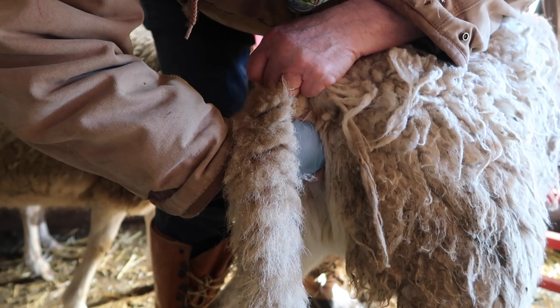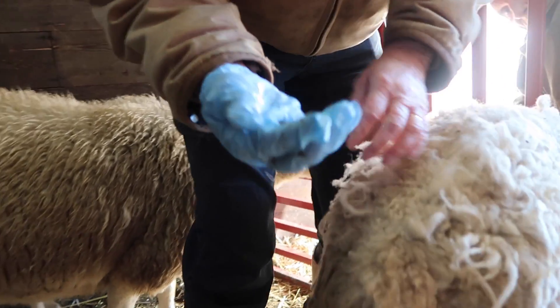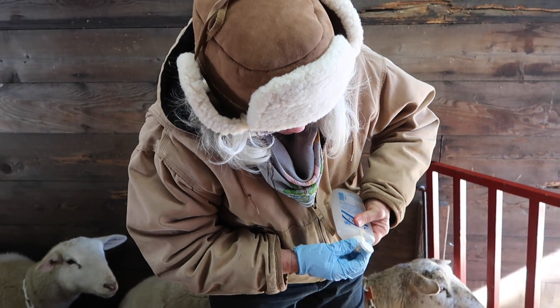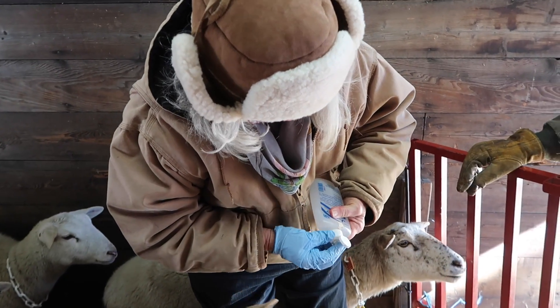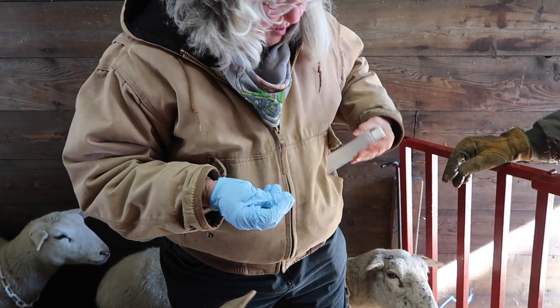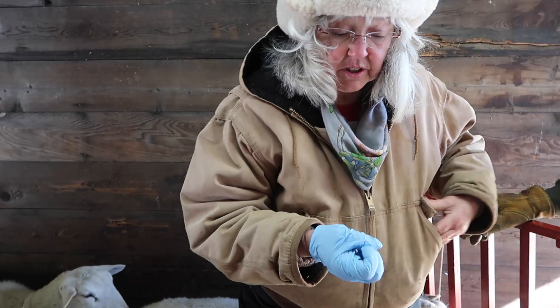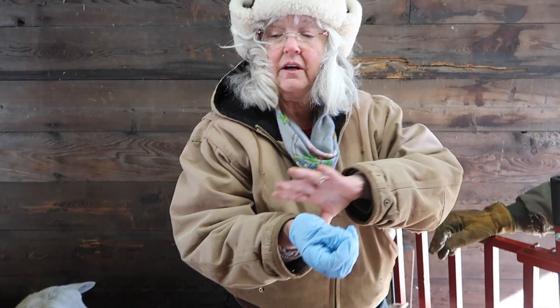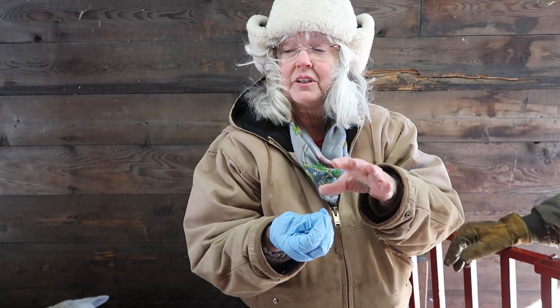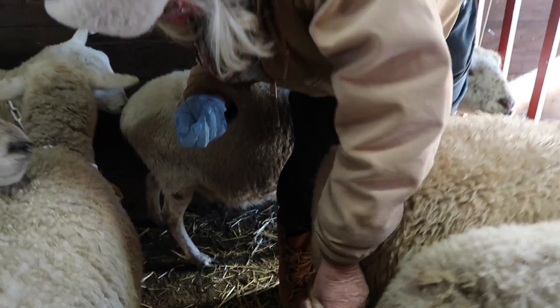The benefit to doing it this way is you know exactly from whom it came. There — there's what we need, just a little sample. What was the name of 600? Just put 600. It's not writing real well. Is this a fresh glove now? Yes, fresh glove. What we did was we turned the glove inside out, and that gives us a way to keep that particular sample without cross-contaminating it.